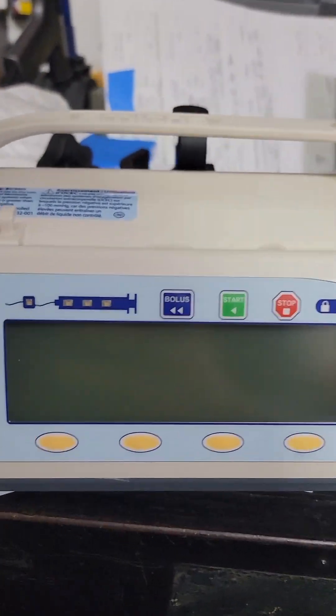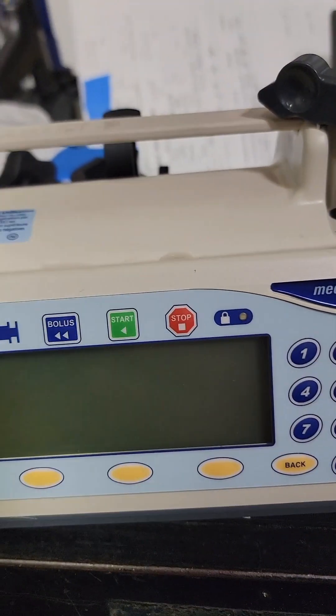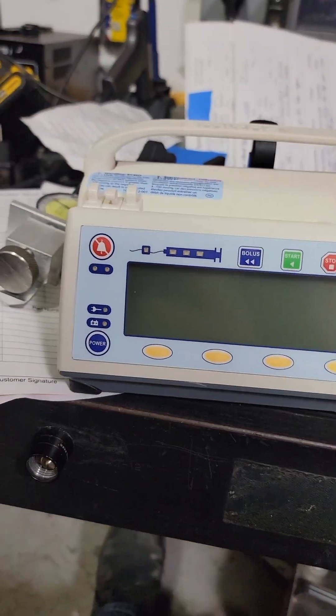Here is the Smith Medical Medhesion 3500 syringe pump. I had an earlier video on this, but we're reshooting this anyway. So let's go over the syringe pump a little bit.